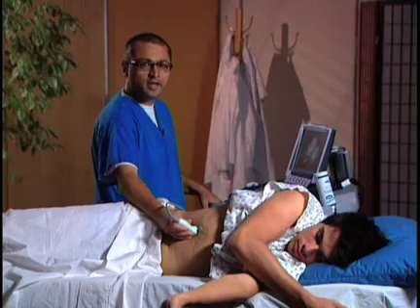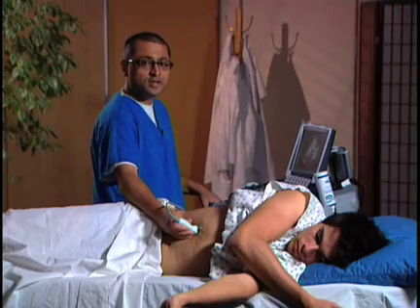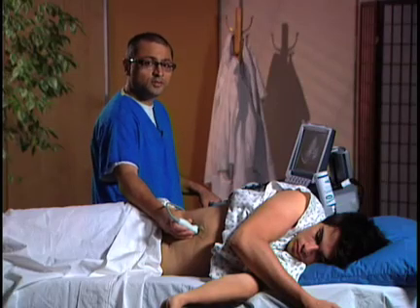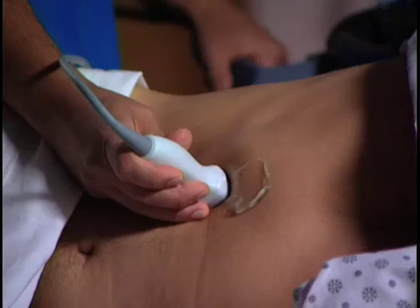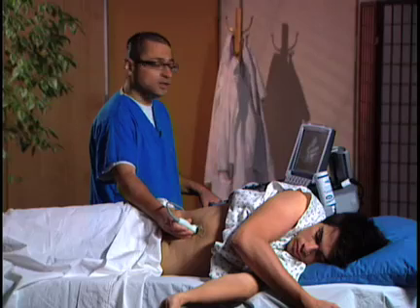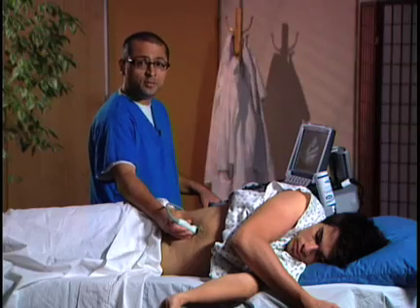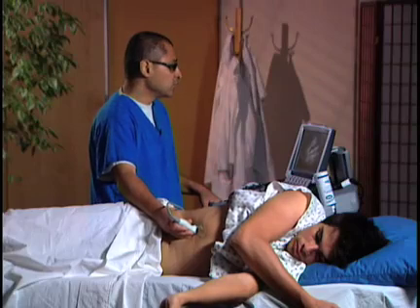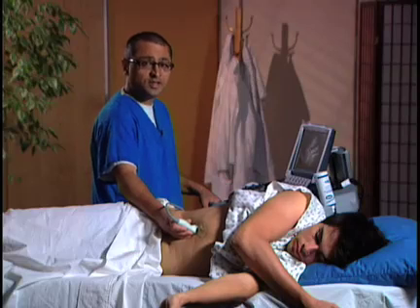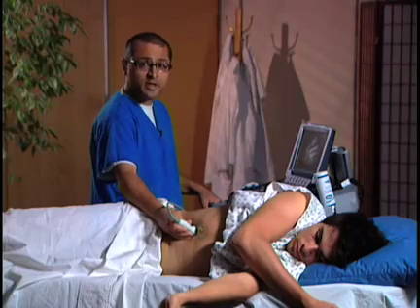Once you've identified the gallbladder in a nice long view, you have to carefully look for signs of a gallstone. Once you see the gallstone, you're going to press gently into the right upper quadrant and see if they have signs of a sonographic Murphy. We're all familiar with what a Murphy sign is — palpation of the right upper quadrant looking for gallbladder tenderness. A sonographic Murphy is much more specific, so we press on the transducer gently to see if that elicits pain.